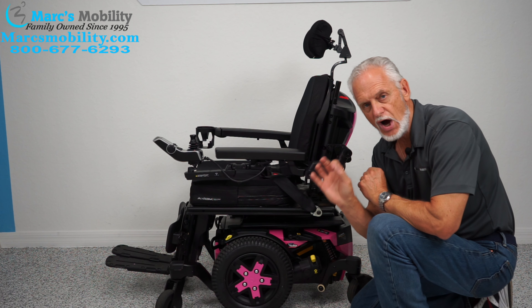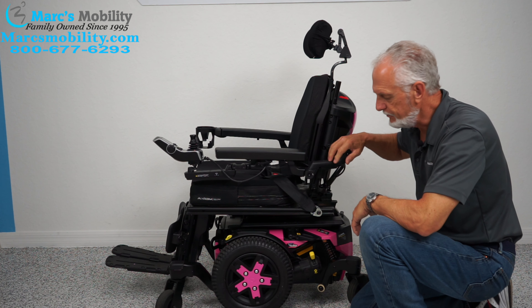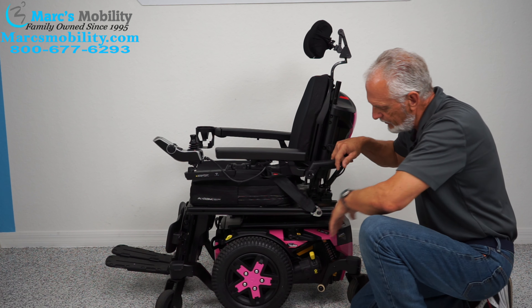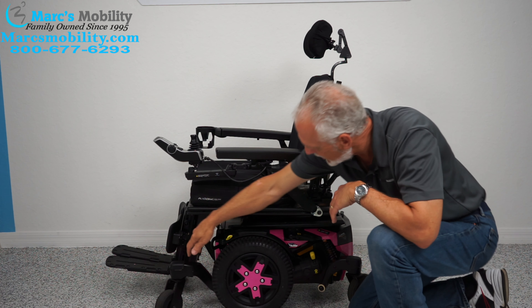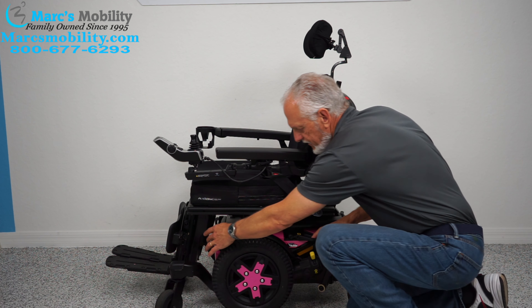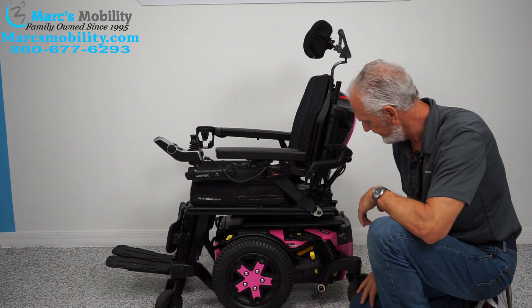When you're done, do not forget to put the lever back up. I get a lot of calls from people who move their chairs and forget to re-engage it, and then it's beeping. These are your anchor points — you've got one here and one right here, two on this side and two on the opposite side. This is where you secure your chair to your lift or van for transport.